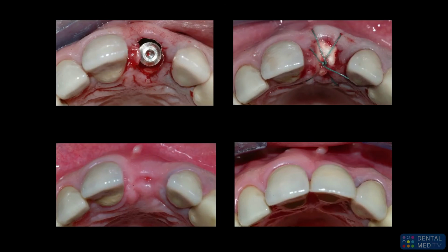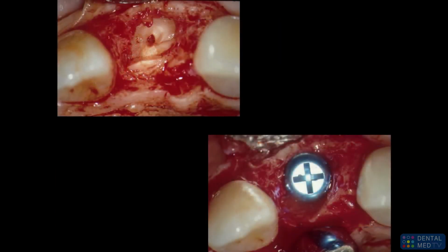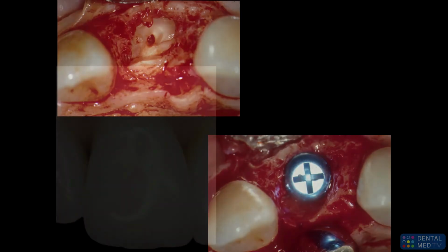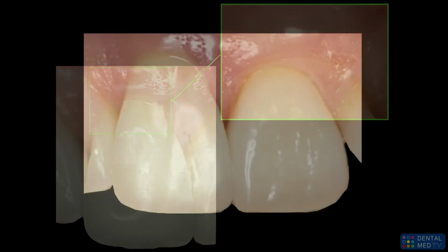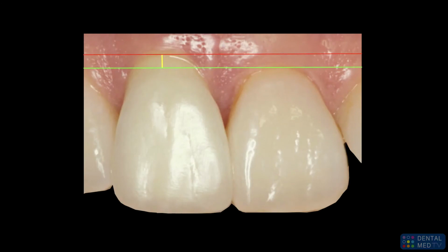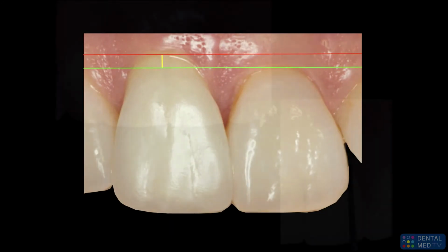The result is very different when we place the implant the same way but do not fill the gap. Maybe we cannot face a gingival recession, but we have a huge reduction in the horizontal width. And placing a wider implant, like we did at the beginning 20 years ago, can develop a recession by itself. And even if the result around such a facial implant is not so bad, it is every time in recession compared to the reference contralateral tooth.